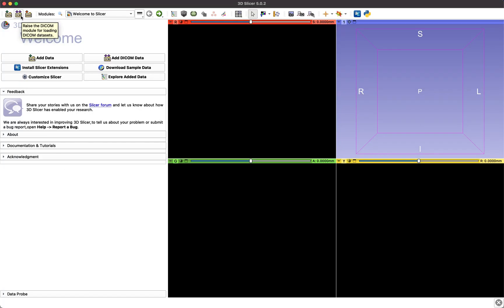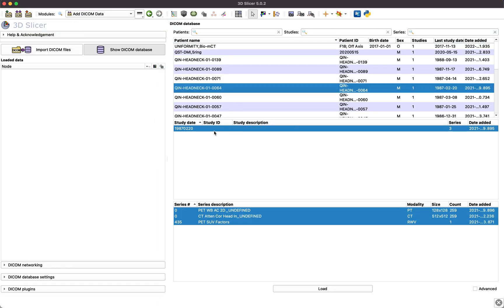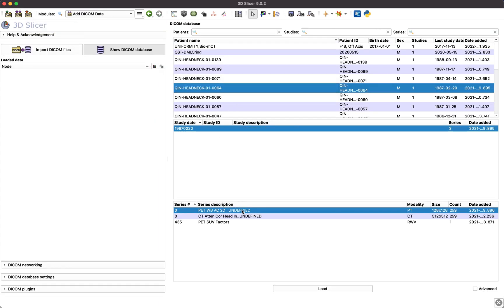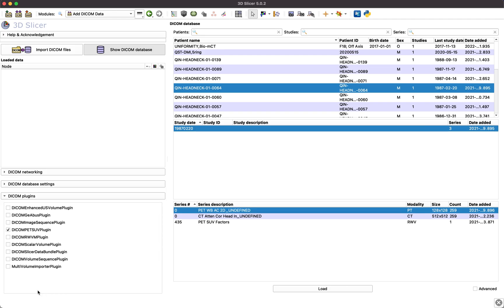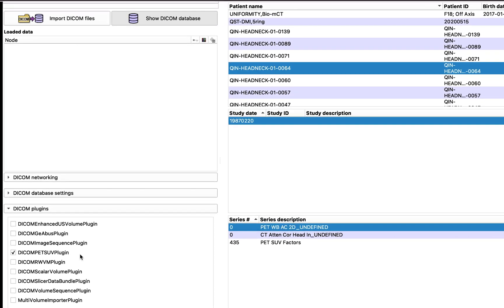To load a PET scan as an SUV normalized data set, open Slicer's DICOM browser and select the PET scan you wish to load. Under the Advanced tab, make sure that the PET SUV plugin is enabled.